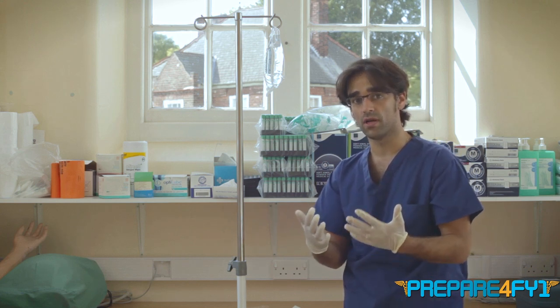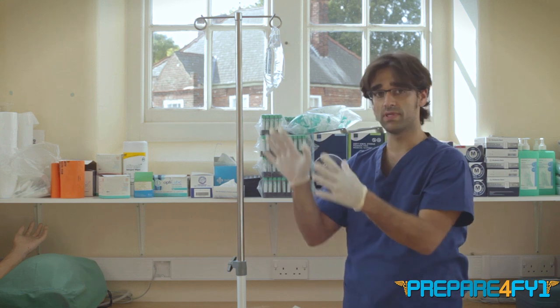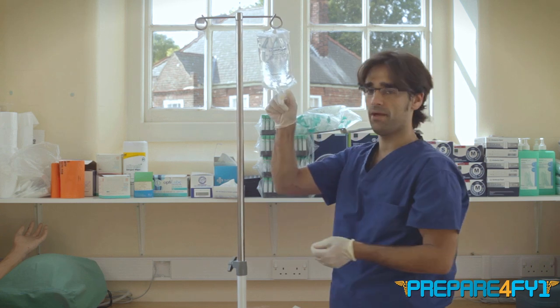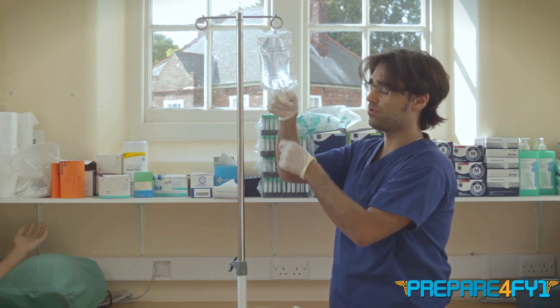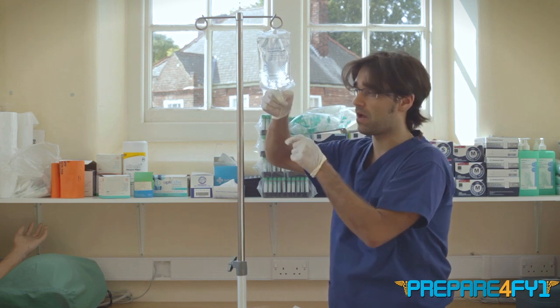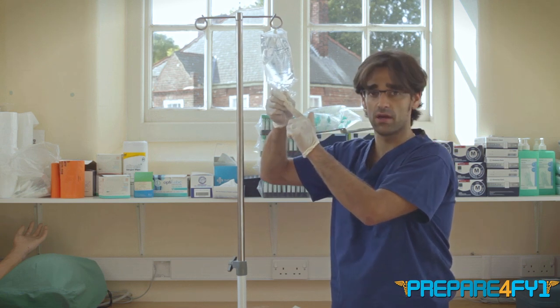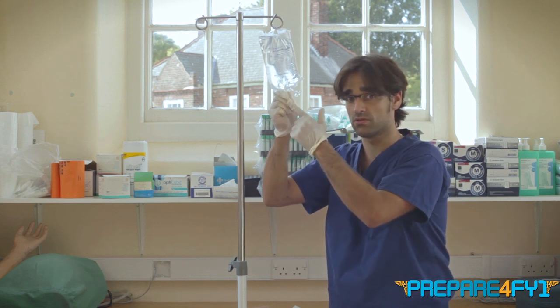Now you've got your gloves on and you're sterile, with your fluid hanging there. Since you haven't desterilised the bag and your hands are clean, you can remove the cap with a twisting motion and connect the giving set to the port where you've removed the cap. The injection port is where you would clean and add potassium or any other additives — you do not connect the giving set to this port, as I've seen some students try to do before finals.